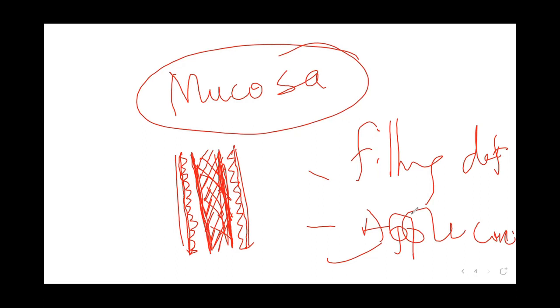If there is any lesion, you see it with your eyes. You now pick a biopsy for histology. And of course, when you are doing colonoscopy, the evaluation of the large intestine is actually done during withdrawal of the colonoscope.